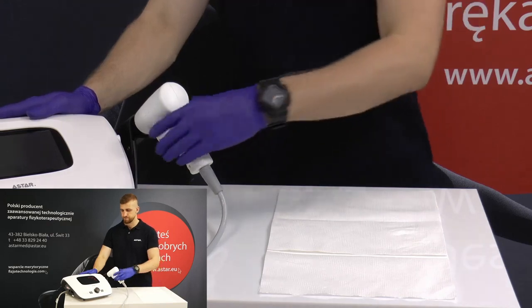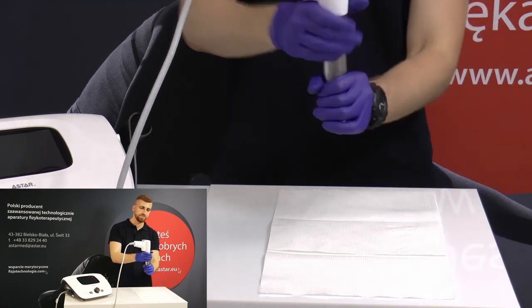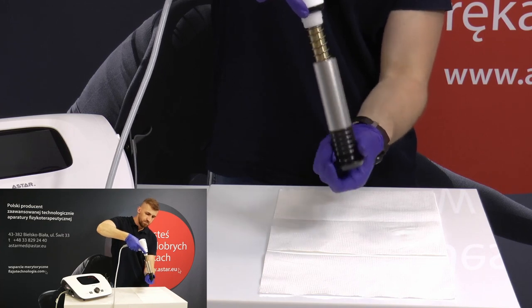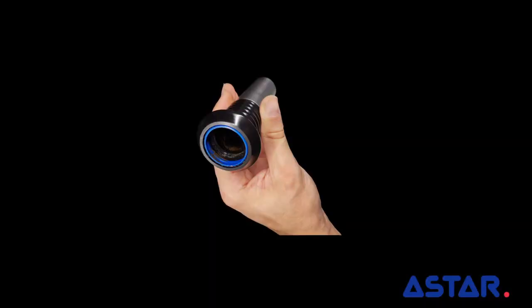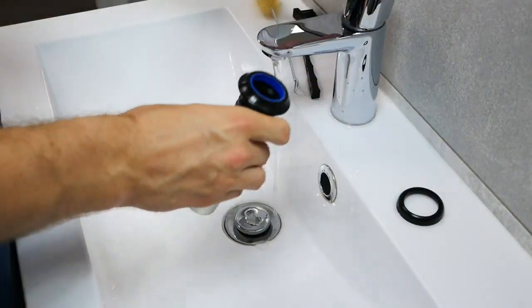Remember to perform all the actions holding the applicator with the mouth of the barrel pointing towards the floor. Unscrew the tube of the applicator, taking off the clamping ring, and check if there is no trace of moisture, gel or other impurities inside the tube. If you notice any moisture or impurities, wipe it off or wash under running water.